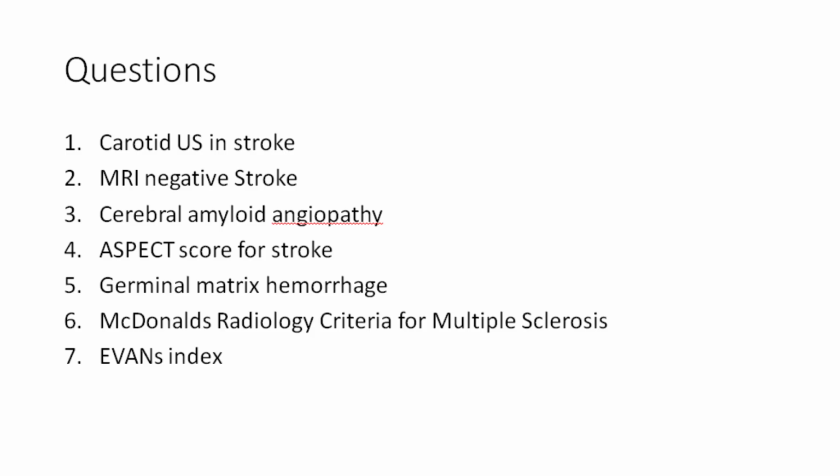I see it so frequently in clinical practice, and I feel it's useless. Why? Because it doesn't give you the vessel wall. You want to know about the plaque, you cannot get the idea. You want to know the location of the critical stenosis, you don't know. So I never do carotid ultrasound. I would rather go for MRA for renal failure patients, but I will not do a carotid ultrasound.